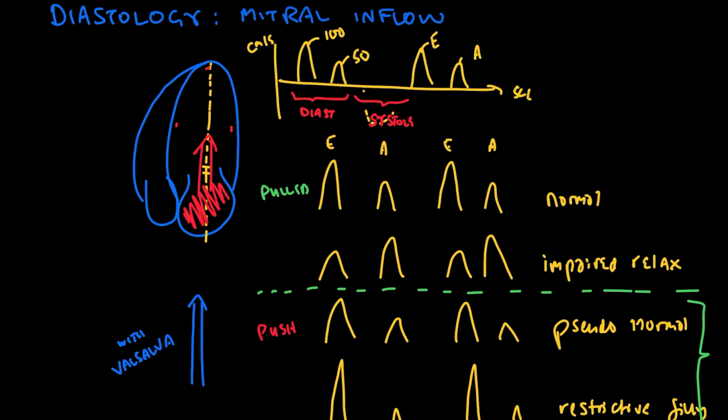Hi, this is Stephen, and in this video we will continue our study of diastology, or how the heart fills with blood, the left ventricle in particular. And in this video we're going to put together two concepts from previous videos.